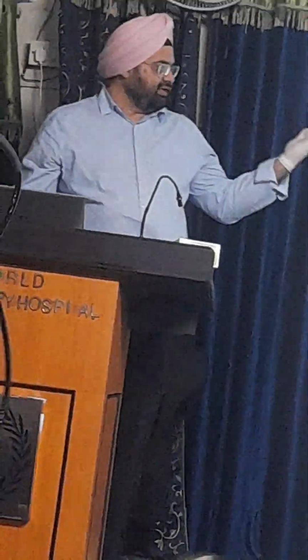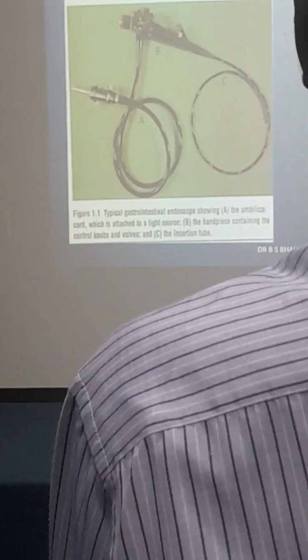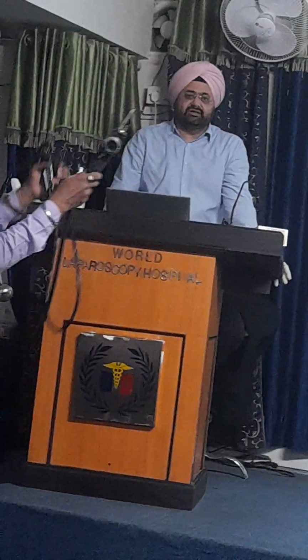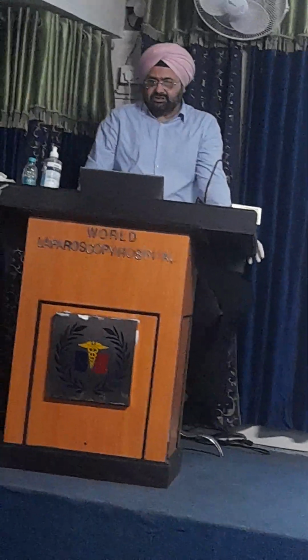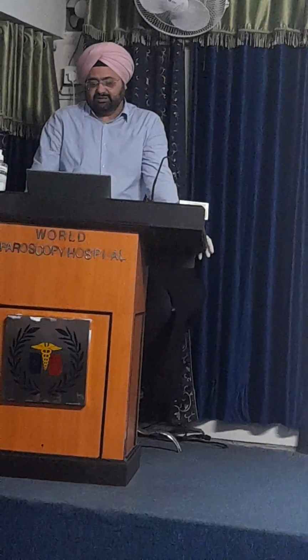Anywhere it is possible, whether they are radio signals, light signals, any kind of sound signal, or microwave signals, you can modify them. So this is the limitation of your fiber optic scope, which I have already told you. There is no monitor for image. There is no image processor. There is no image. You cannot capture the image.